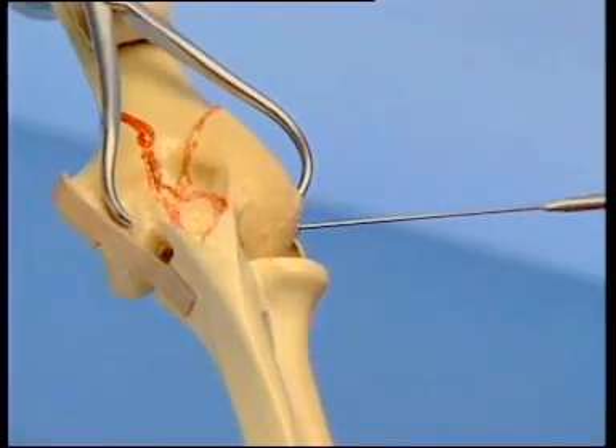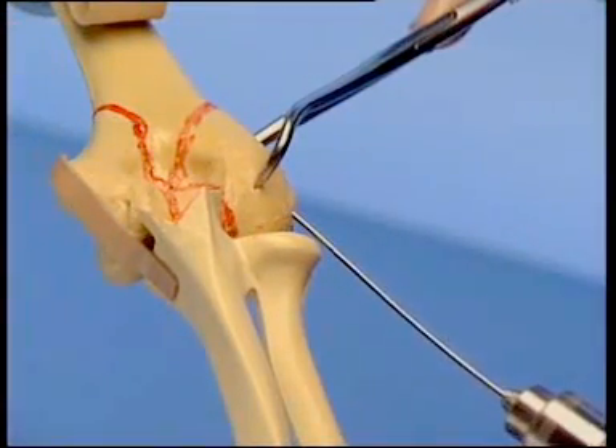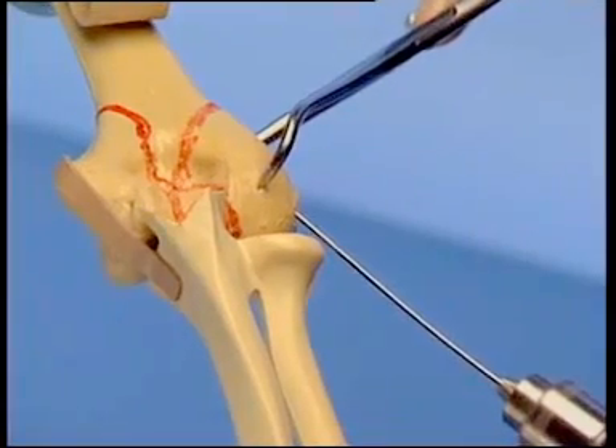Clamps and K wire are removed. K wires and/or pointed reduction clamps may be used to hold this second step.